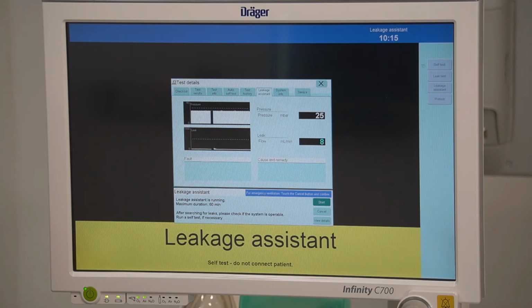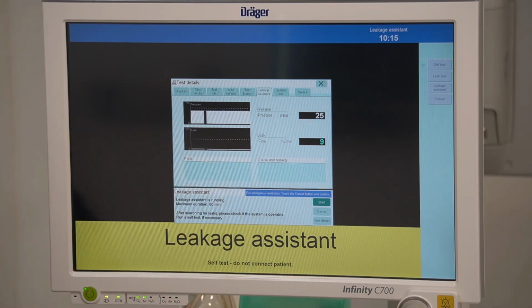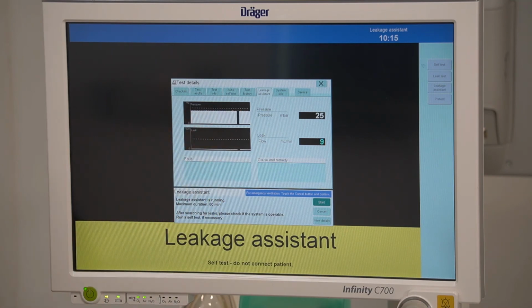Once a pretest has been completed, the device will automatically commence the 8-minute system test. On completion of the system test, the device will return to the standby screen. Results of the system test will be indicated here, and there are three different colour results.